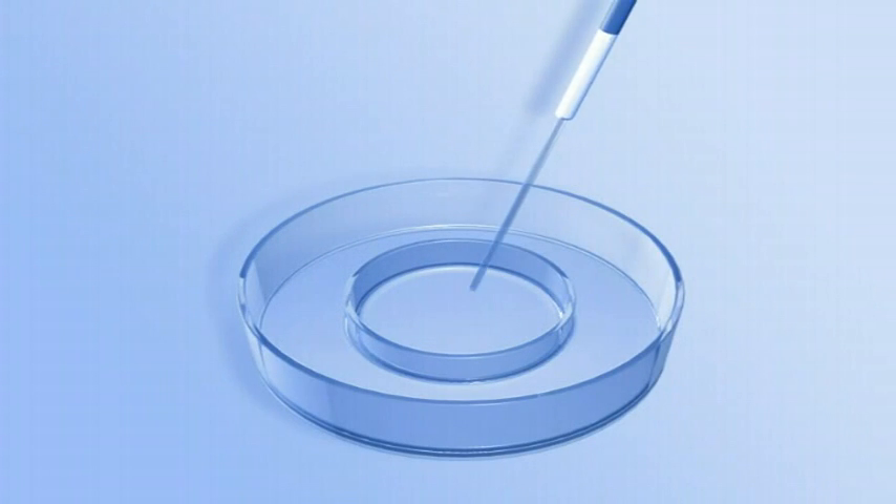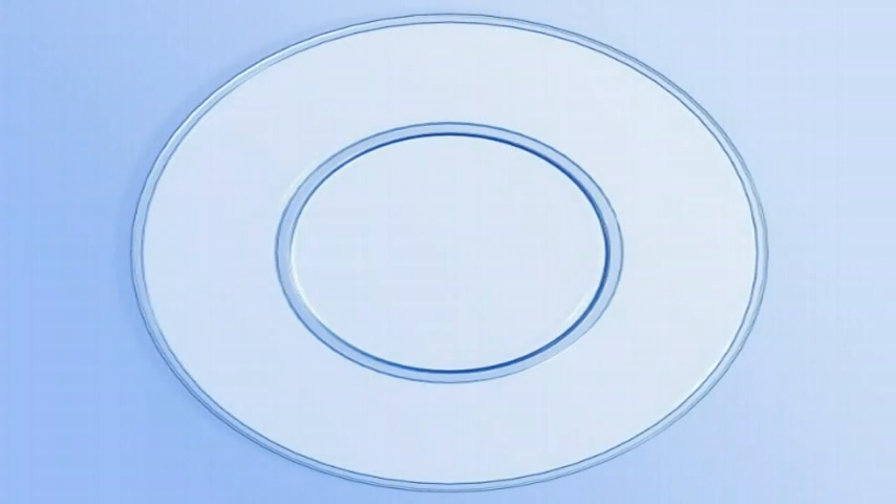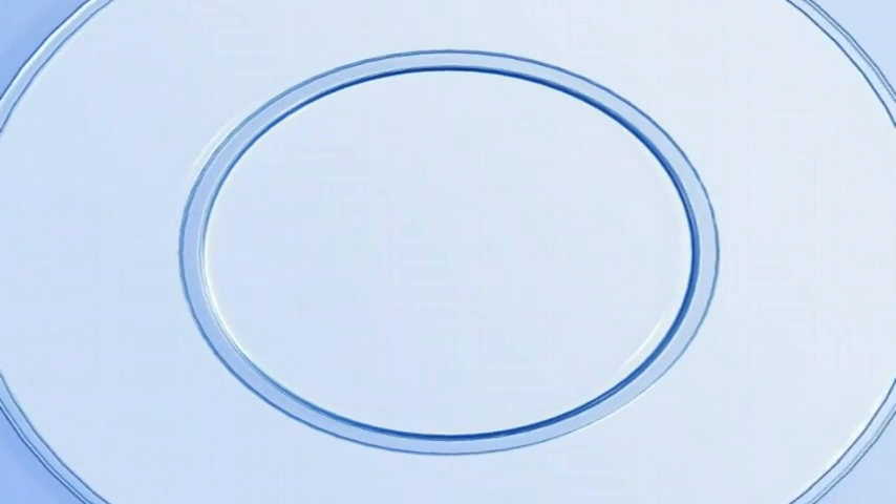After embryo transfer, flush the catheter with medium from the transfer dish and make a microscopic examination to ensure that the embryos are not stuck inside the catheter.